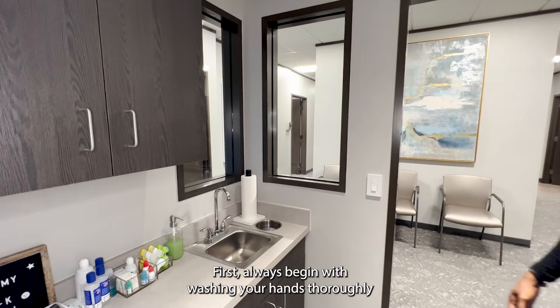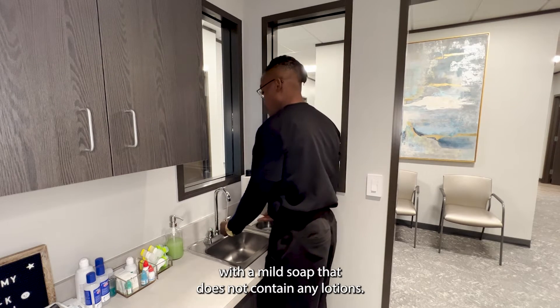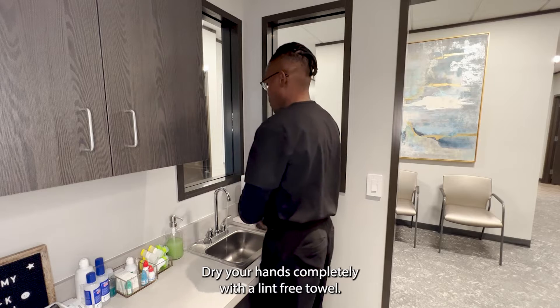First, always begin with washing your hands thoroughly with a mild soap that does not contain any lotions. Dry your hands completely with a lint-free towel.